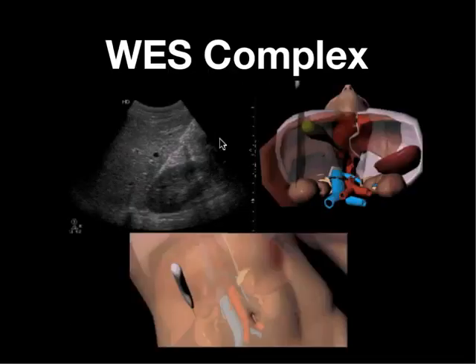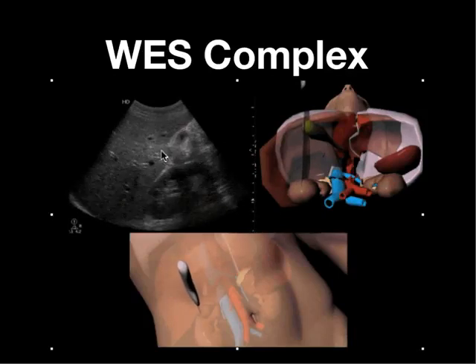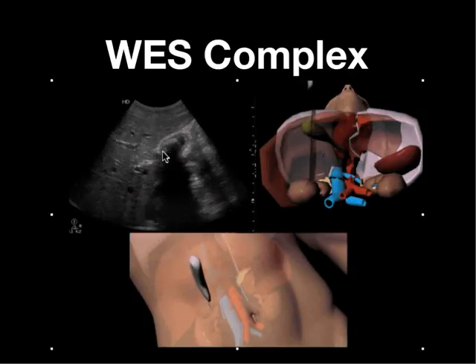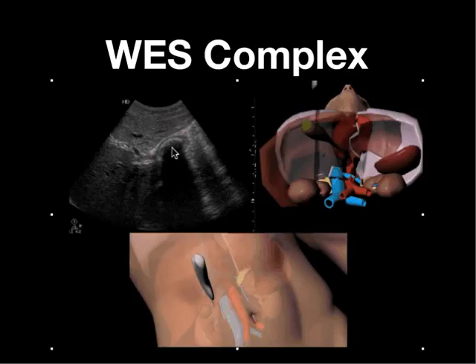In the literature you'll see the term WES complex used — that means wall, echo, shadow — and that's what you're going to see when you've got a gallbladder packed with multiple stones or one large stone: the wall, the echo, and the shadow. On this patient you really don't see any bile — it's just the wall, the echo, and the shadow.